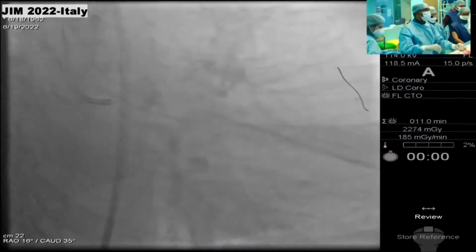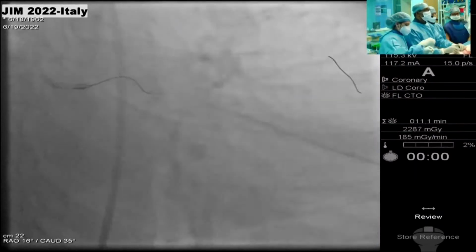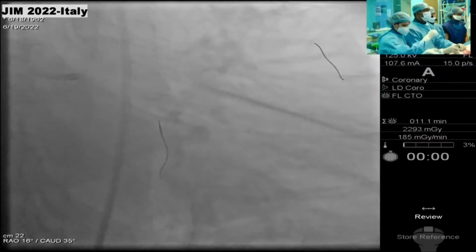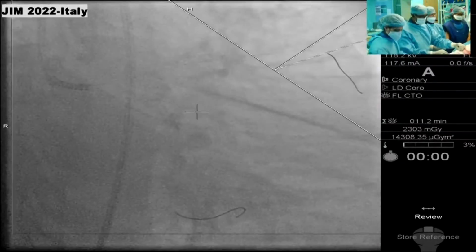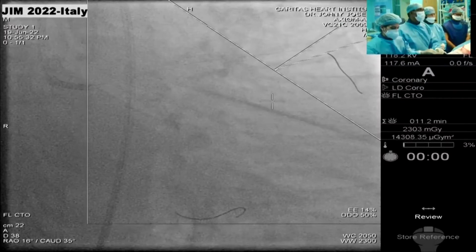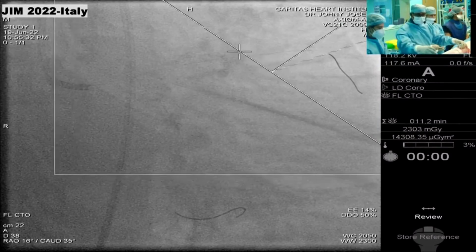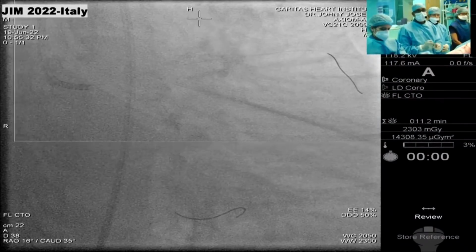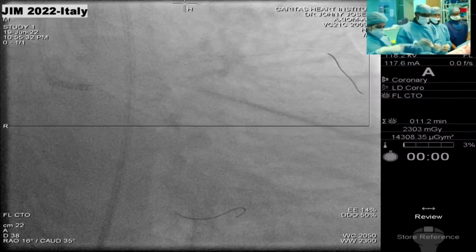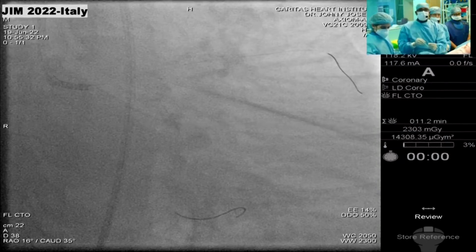as Davidson himself has also suggested. And of course, looking at the other features of the bifurcation, the angles are all favorable. And definitely the distal left main disease, probably we'll have to treat that also, treating it as a crossover from the left main into the LAD. So what was the diameter of the balloon that was used initially? Well, let's hold on for a moment because I have some more comments.